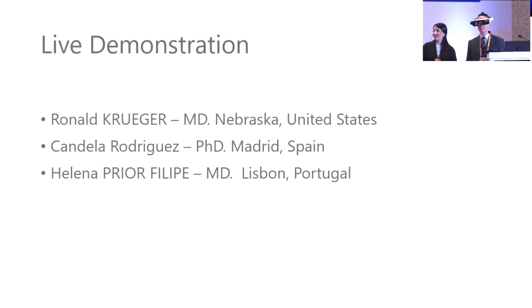Okay, so we can see that this experience will help us a lot, and especially will help the patient a lot in terms of selecting and taking a shared decision of what would be the best choice for the patient. So maybe we'll try to see what a bilateral trifocal looks like for me. Okay, let's try a trifocal. One minute to make it happen. Okay, so this is trifocal.